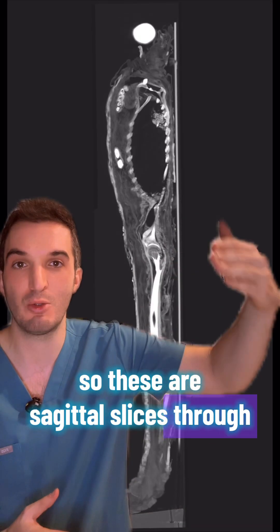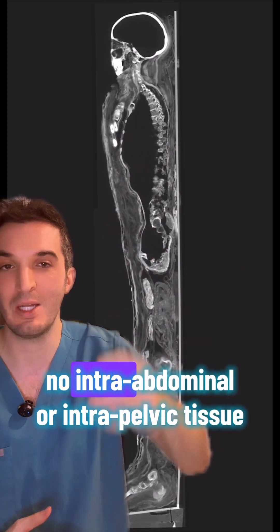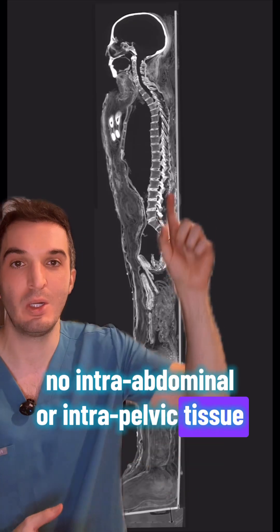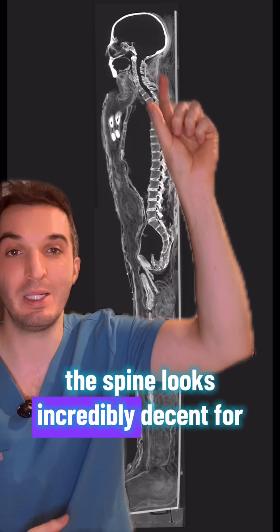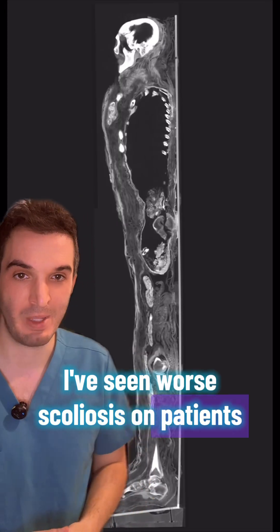These are sagittal slices through the body — hollowed out here, no lungs, no intra-abdominal or intra-pelvic tissue. The spine looks incredibly decent for being 3,000 years old. I've seen more scoliosis on patients today.